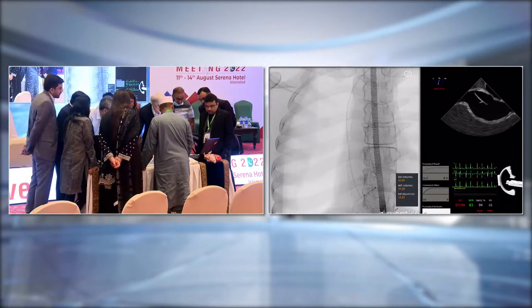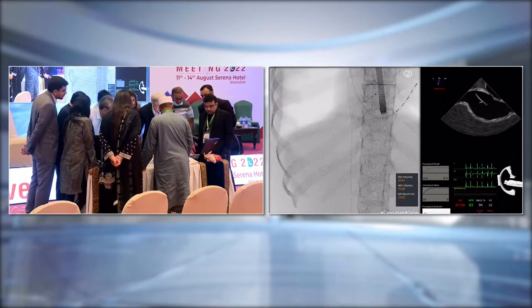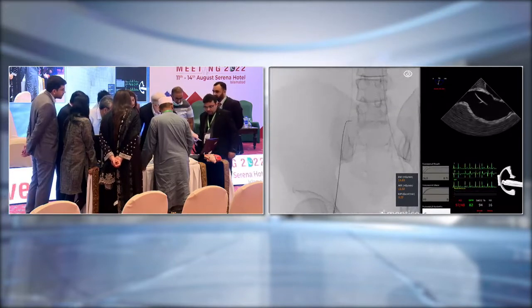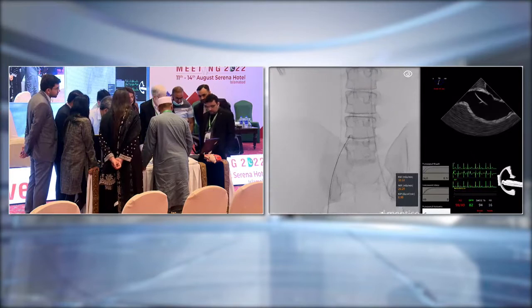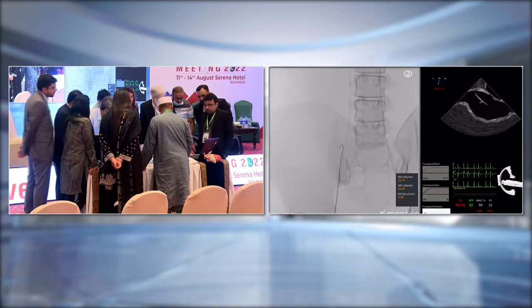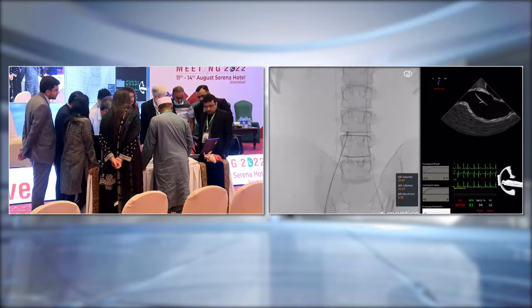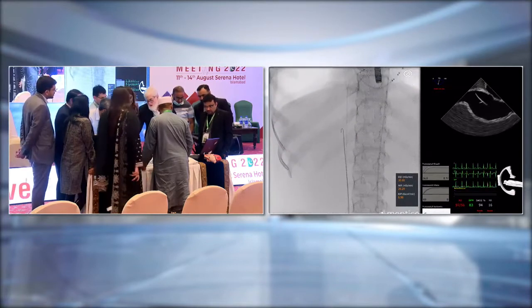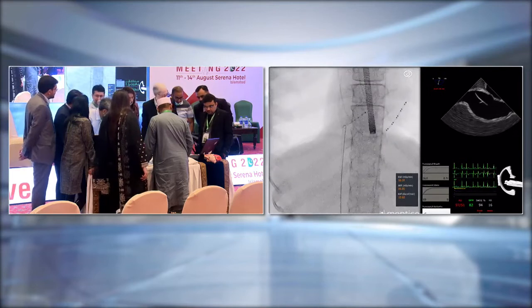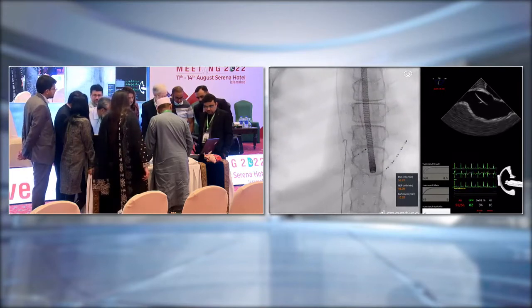अब आप पुश करें. वार कहाँ? Now it will automatically. वायर है किधर? ये सर वार अब आ गया. So femoral axis के through auto tracking के through में आ गया. सर ये याद रखना रेडिएशन ज़्यादा नहीं खाना. There is a system auto tracking, and there you can go manually with these buttons. You can auto track any tip which you are integrating.